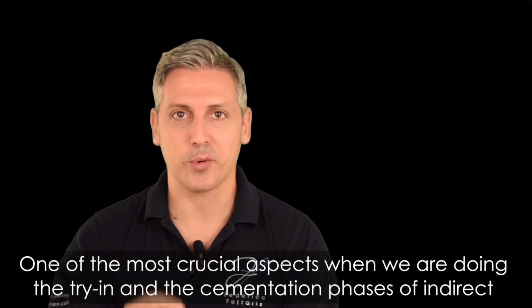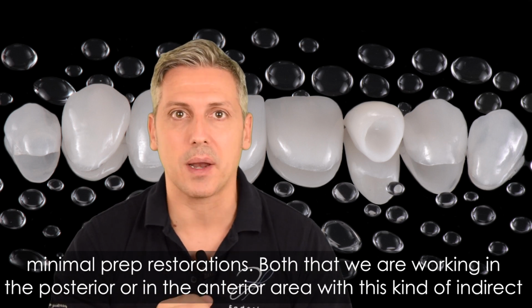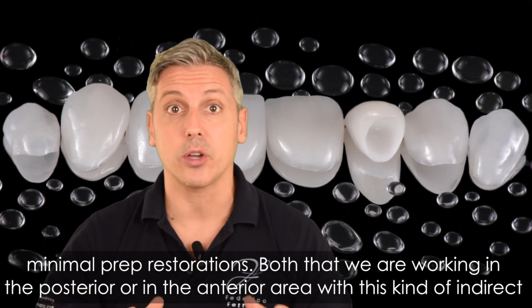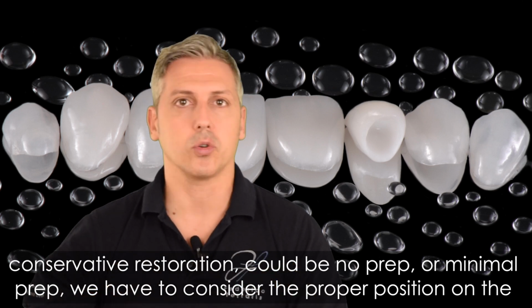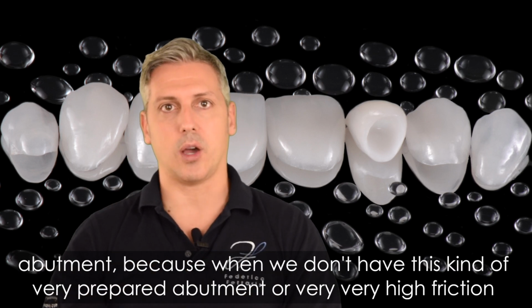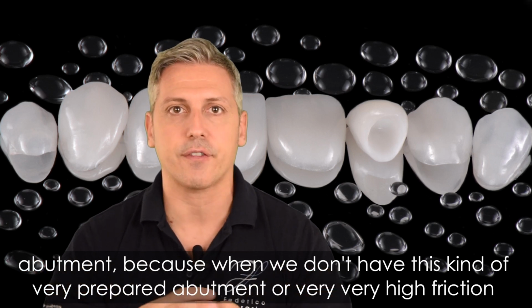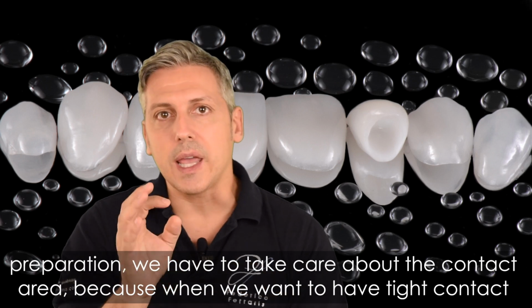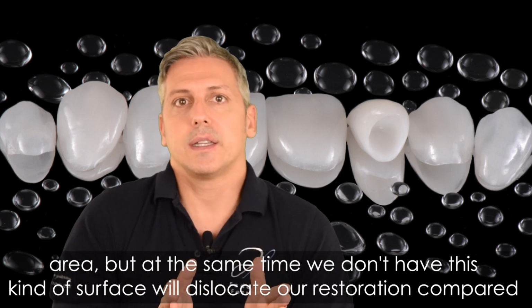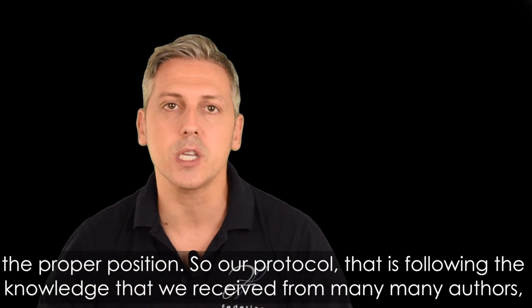One of the most crucial aspects when we are doing the try-in and the cementation of indirect minimal prep restoration, whether we are working in the posterior or anterior area with this kind of indirect conservative restoration, could be no prep or minimal prep, is that we have to consider the proper position on the abutment. When we don't have a very prepared abutment or a very high friction preparation, we have to take care about the contact area, because we want a tight contact area, but at the same time we don't want this surface to dislocate our restoration from the proper position.